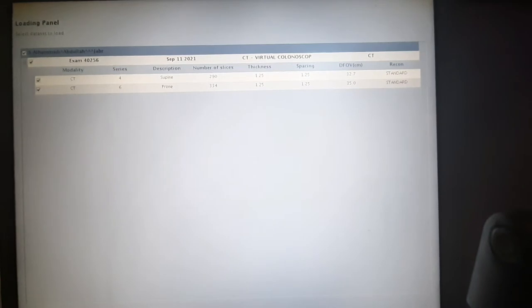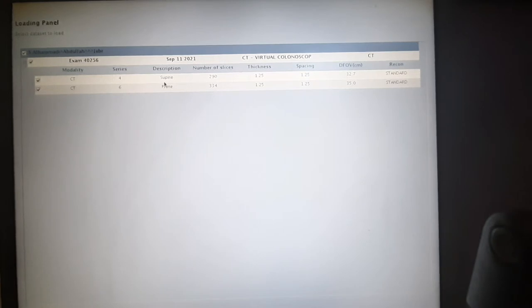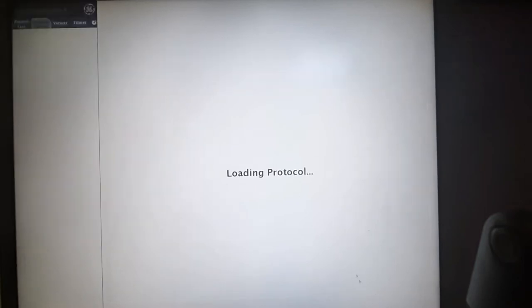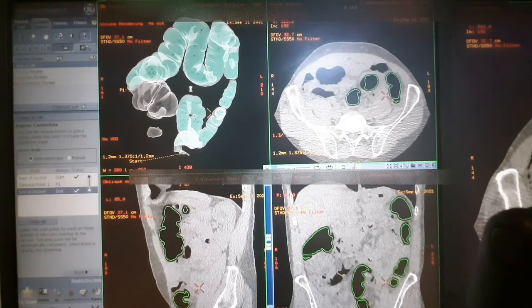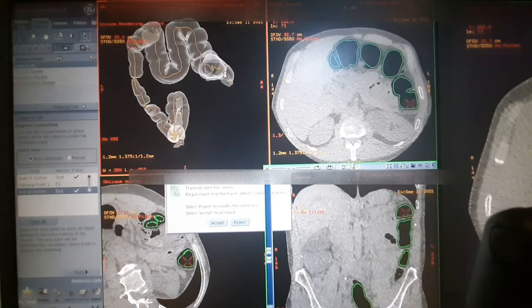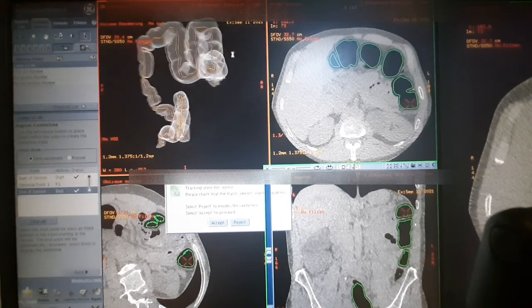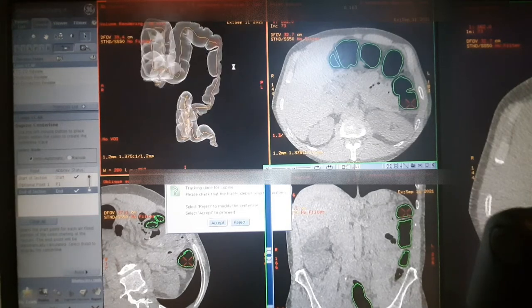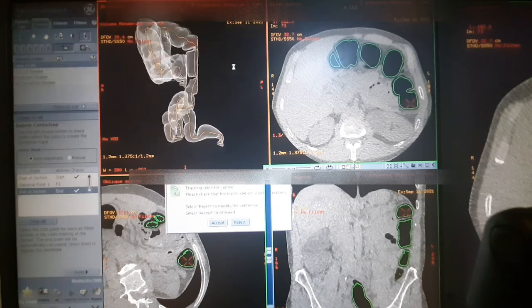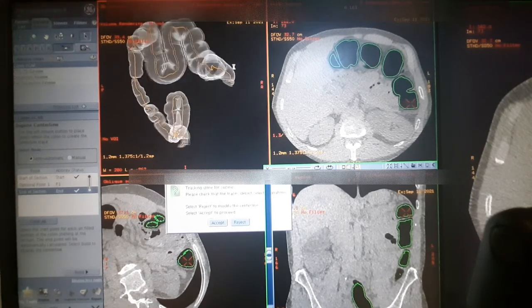For CT virtual colonography you should scan the patient both supine and prone with the same technique, filling the colon with gas using the catheter and the inflator pump. When you succeed with these two procedures, supine and prone, you can proceed. The machine on the Advantage Workstation automatically traces the colon because it works perfectly when you started with a good filling of the colon with gas.